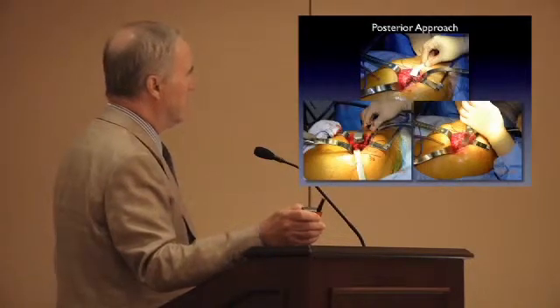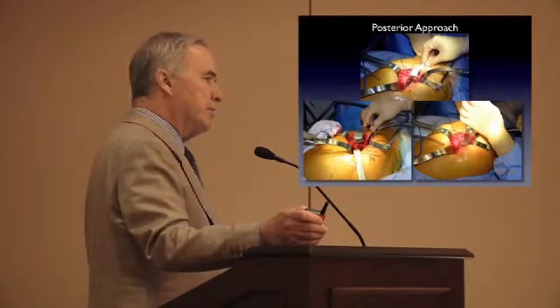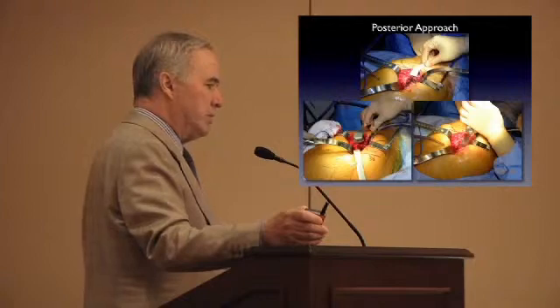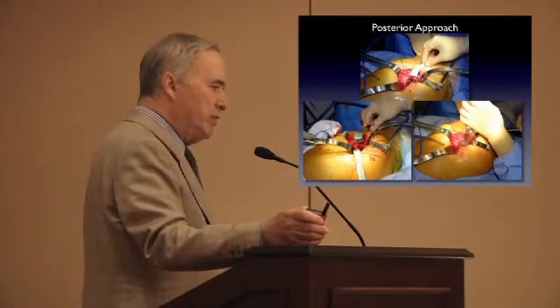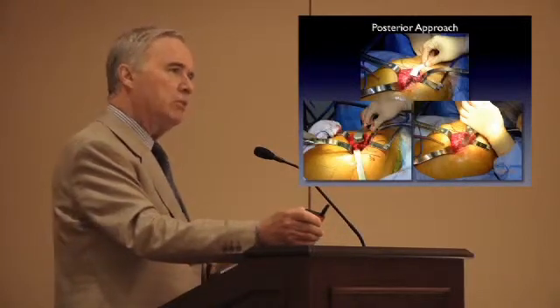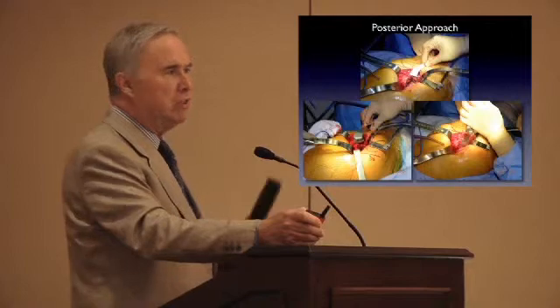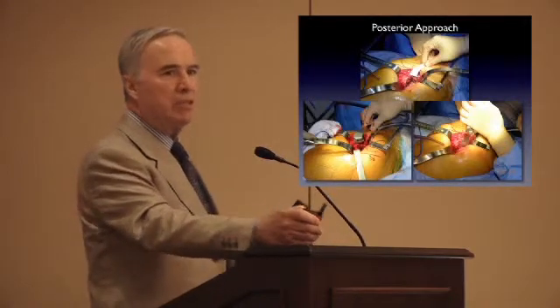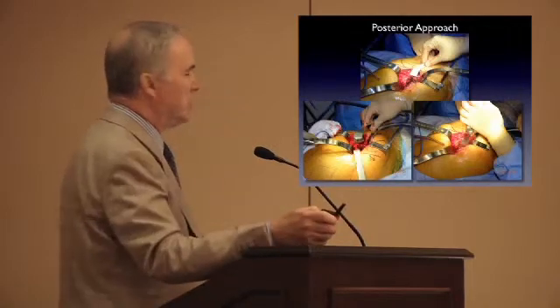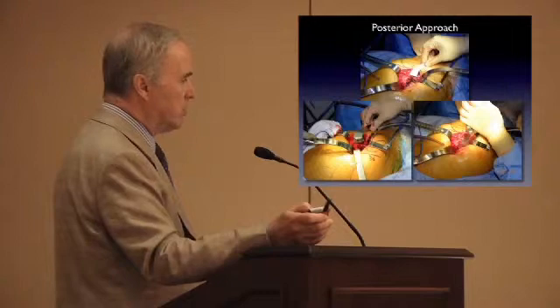So, a straightforward posterior approach. I do the femur first, and that's a departure for me. But once you get your femur prepared, you can then assess your femoral anteversion. Do you have 5 degrees of anteversion? Do you have 20 degrees? Based on that, you can look at your acetabular placement, because relative to stability, anteversion is additive. So I think doing the femur first is valuable.